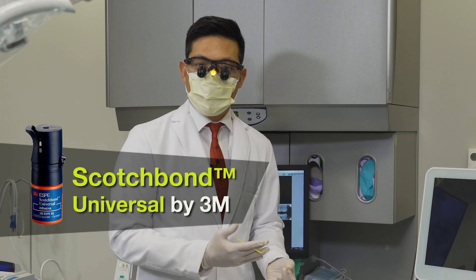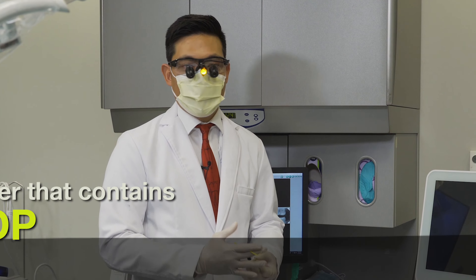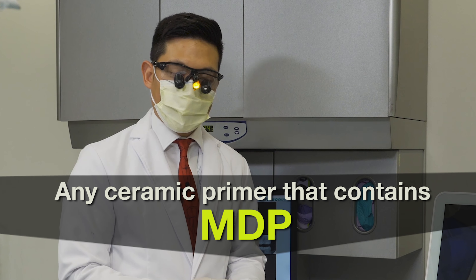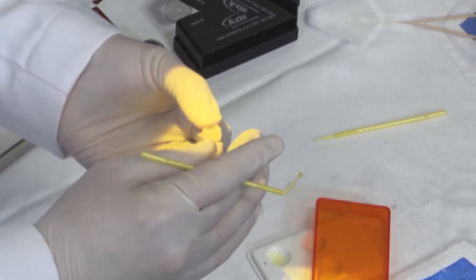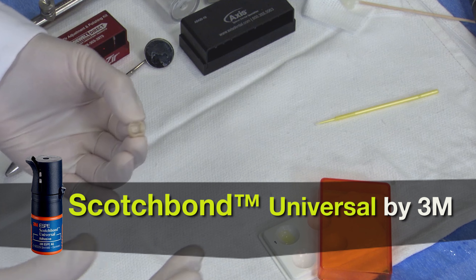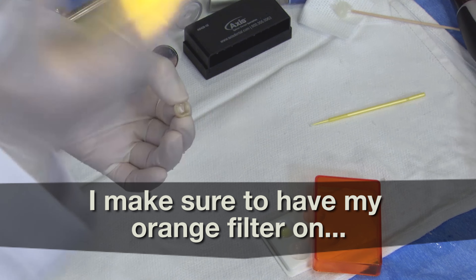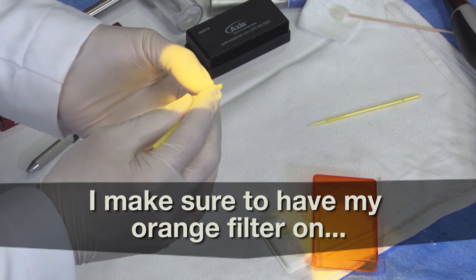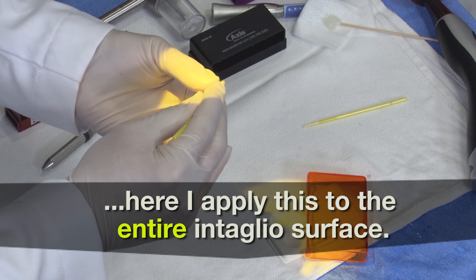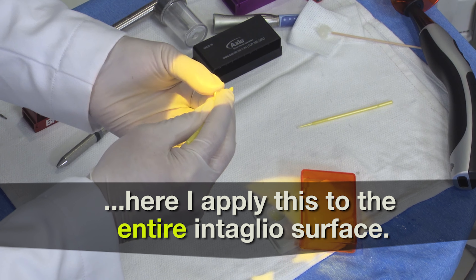In this case, I'm using a universal bonding agent. Several of the universal bonding agents also contain MDP, so any ceramic primer that contains MDP is the key when bonding zirconia. Because I'm using a universal bonding agent, the bonding agent also contains some methacrylate and light-sensitive monomers within it. So I make sure that I have my orange filter on, and here I apply it to the entire intaglial surface, because we certainly want that MDP primer to come into contact with the entire restoration.